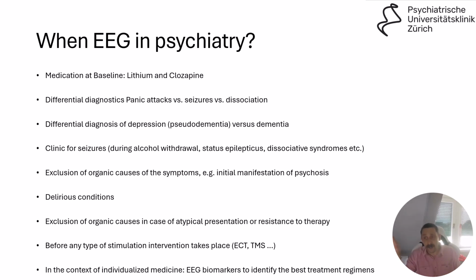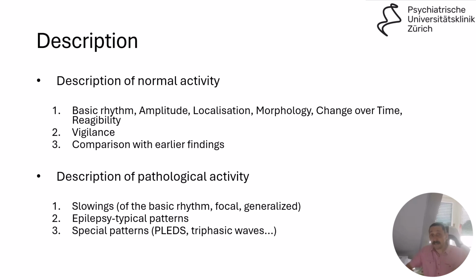There are some on the horizon, so we get a biomarker sheet with recommendations for treatment for every EEG we get in our clinic. So this is the future, and we will address this topic later in our curriculum. So this was a long text.